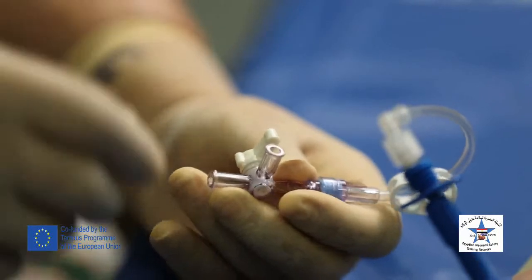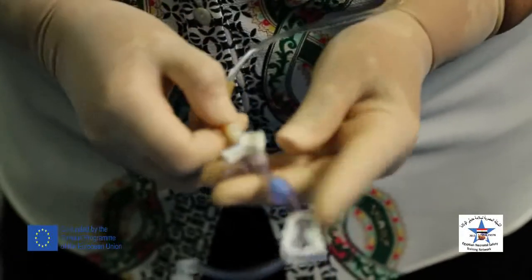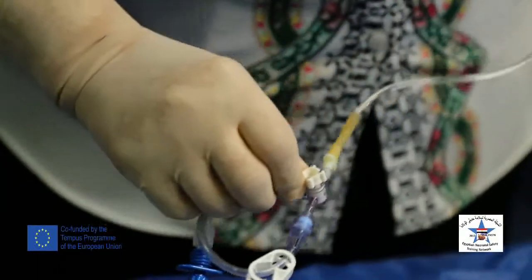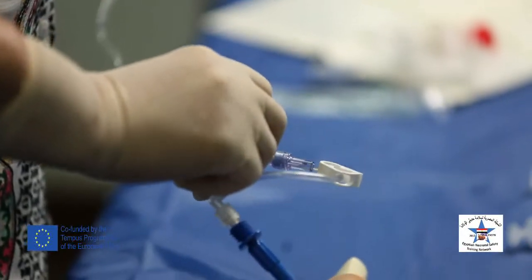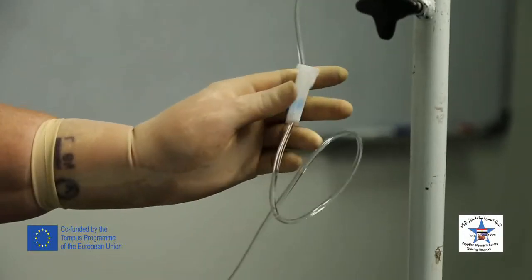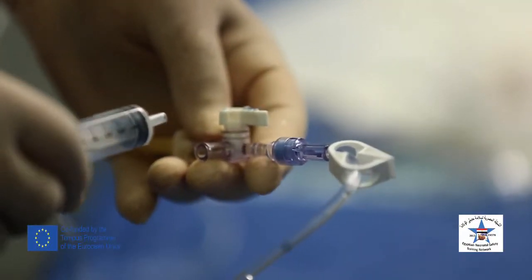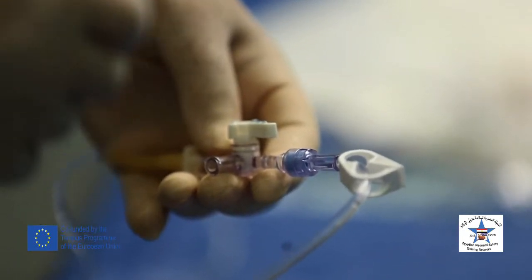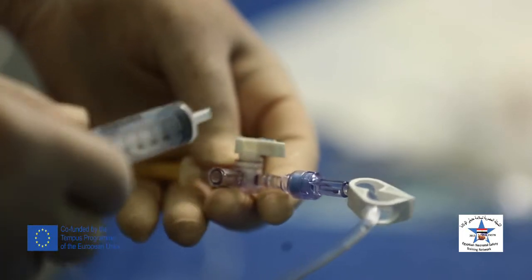Then I will connect my fluid through the three-way and give fluids. This fluid should be run under pressure because in the intraosseous marrow space, the fluid does not go by gravity. It has to go under pressure.